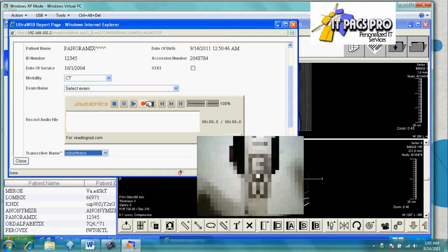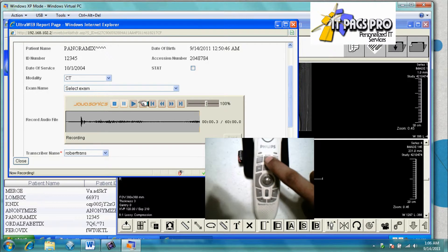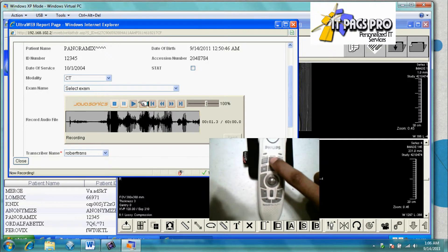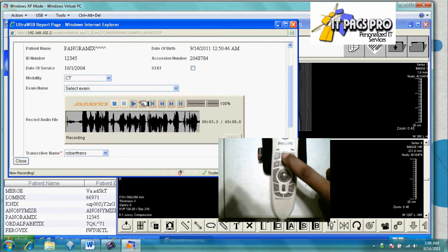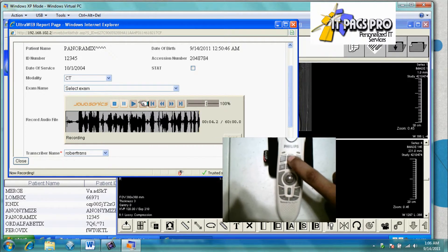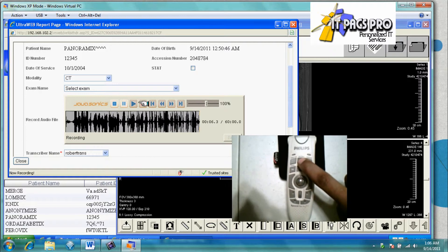Ready for audio dictation, we are fully integrated with the Philips speech mic for the ease of one-handed recording.